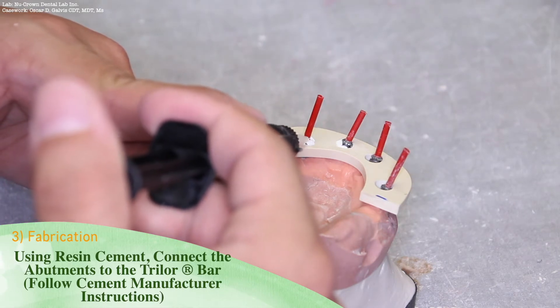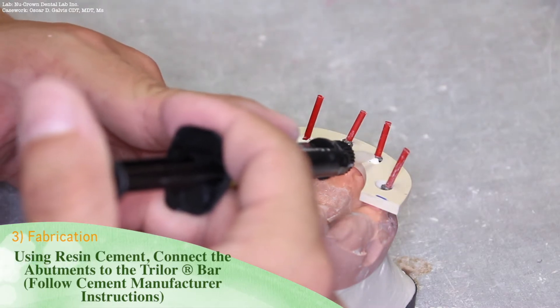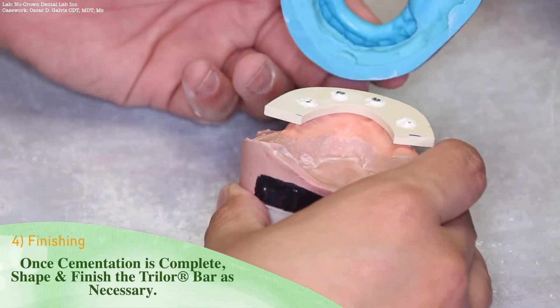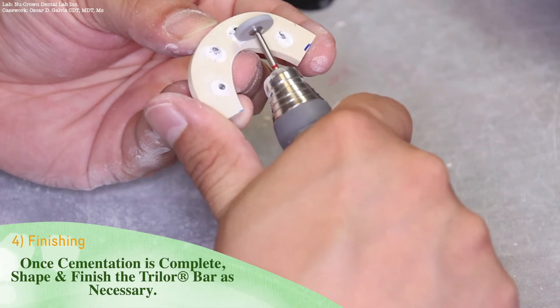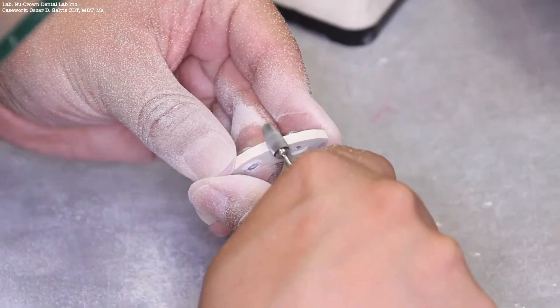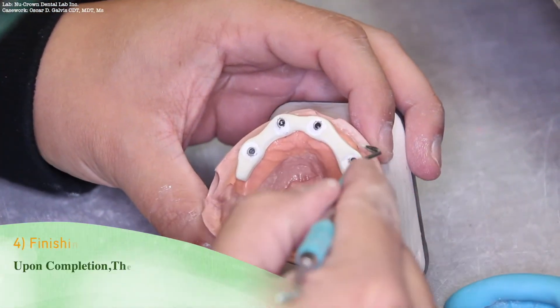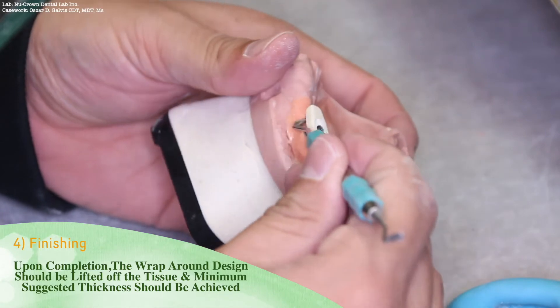Using resin cement, connect the abutments to the Trilor bar. Follow the cement manufacturer instructions. Once the cementation process is complete, you may shape and finish the Trilor bar as necessary. Use the matrix to guide you in the overall contours of the bar substructure. Upon completion, the wraparound design should be lifted off the tissue and the minimum suggested thickness should be achieved throughout the Trilor bar substructure.